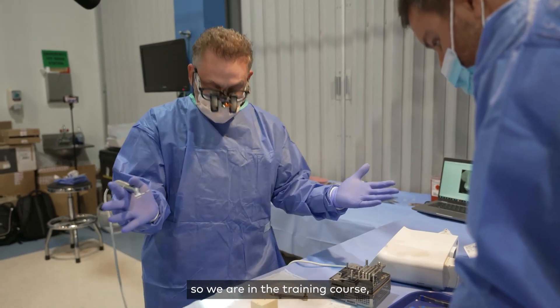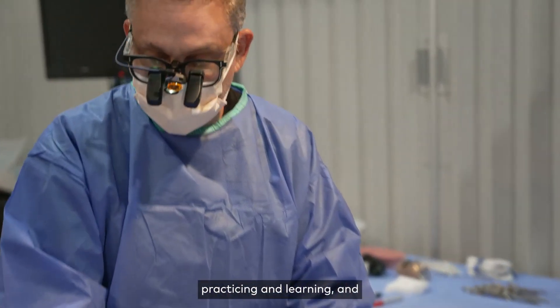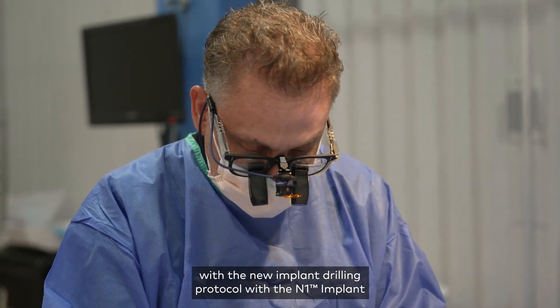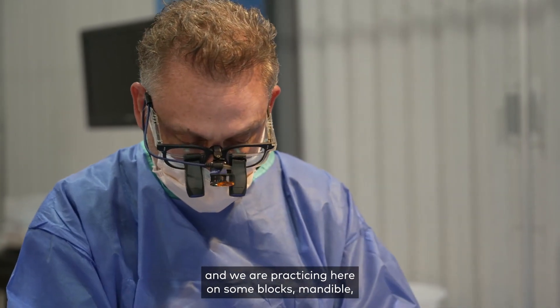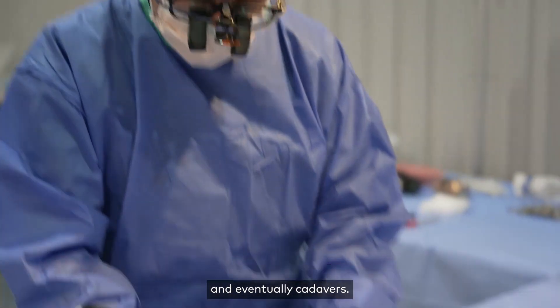We're in the training course practicing and learning and getting some hands-on experience with the new implant drilling protocol and the N1 implant. We're practicing here in some blocks and mandible and eventually cadavers.